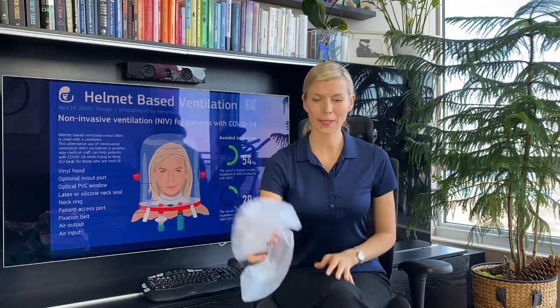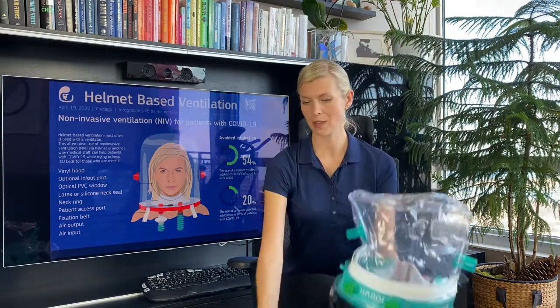The helmets come in different sizes — this is a small size and a large. You can measure the patient's neck and then choose the correct helmet size accordingly. Now I will show you how to connect it to the airflow and how it inflates.